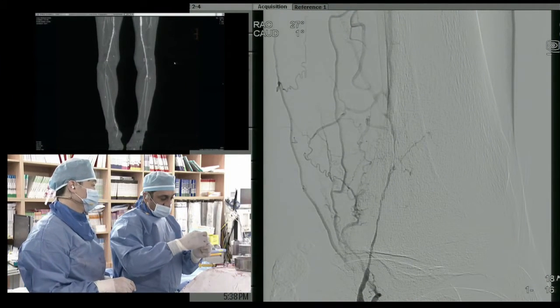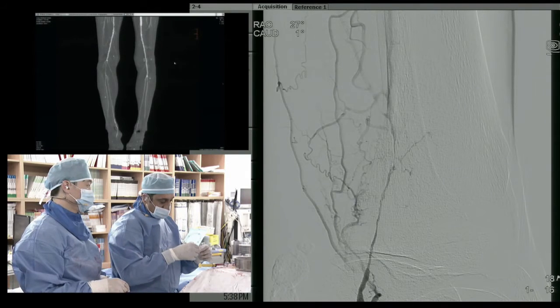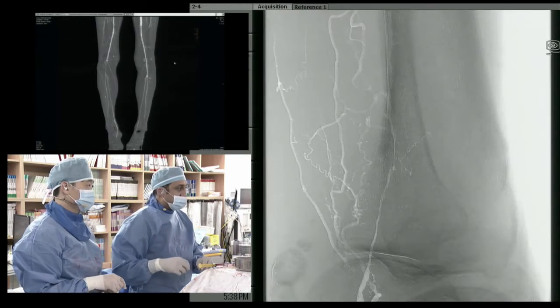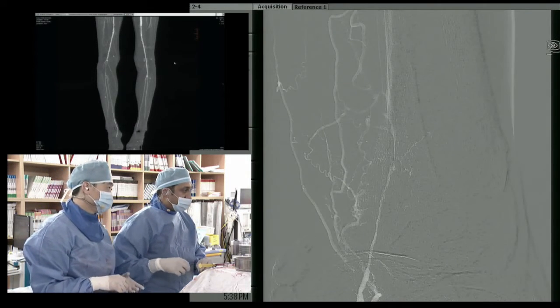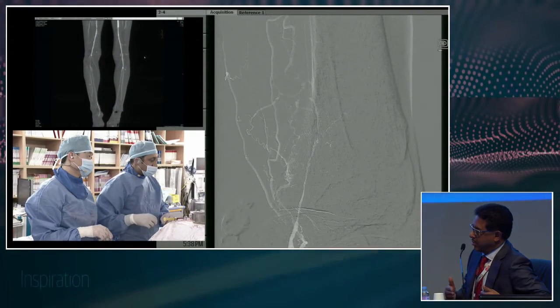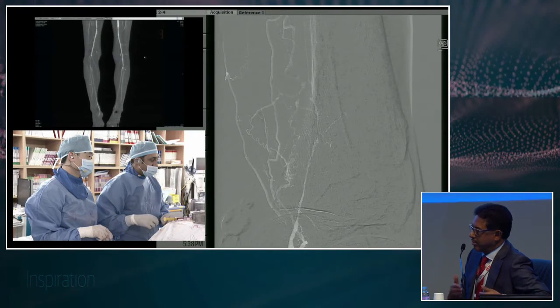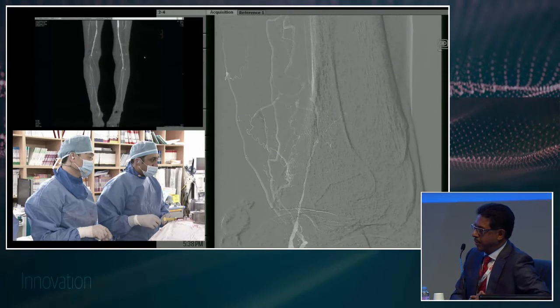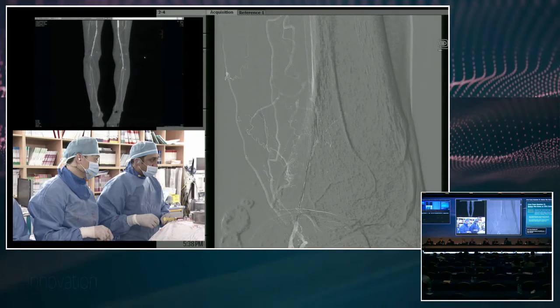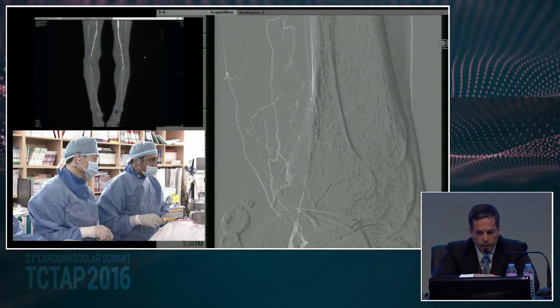So, Lawrence, when do you start thinking about where you say enough's enough, and I'm going to bring this patient back, I've opened up an inflow lesion, I'm going to have some more distal perfusion, I'd like this to heal up, and bring them back? What's your algorithm on that? Understanding that you've sort of done a half job, if you will. How long do you wait, and how do you manage that situation? I really wish I had a better sense of an answer for you. The concern I would have is if we got into something that ended up being more dissected than anything else.